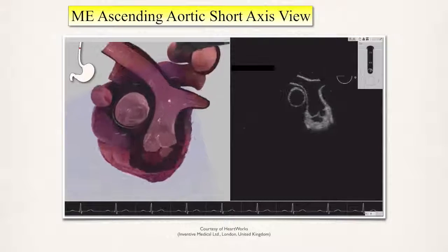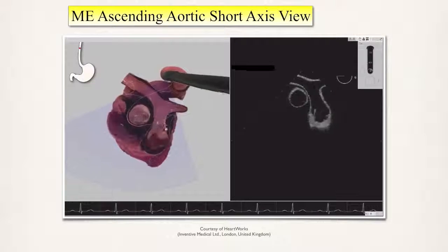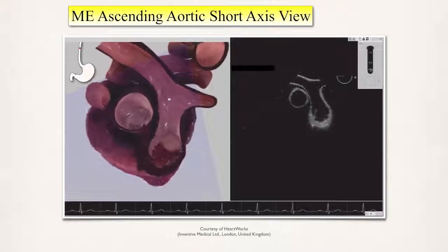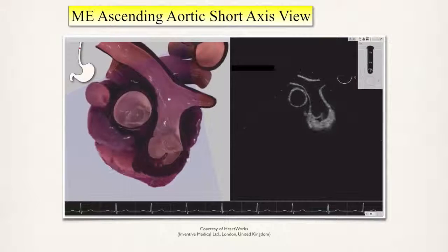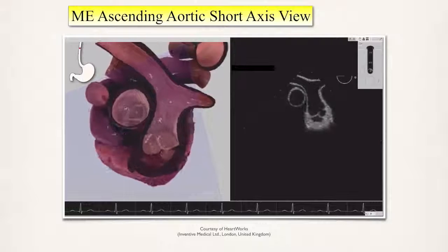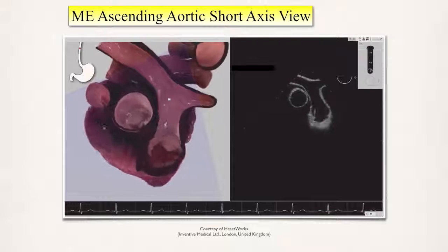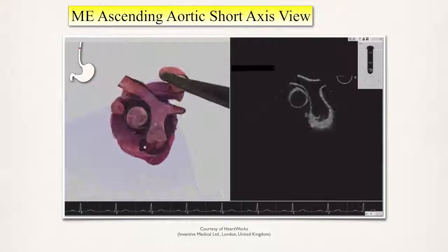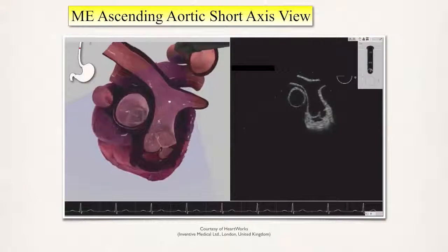This video shows an exceptionally clear view of the structures noted earlier, plus a portion of the left main pulmonary artery after the PA branch, which is rarely seen in adult patients in vivo. The ascending aorta can easily be measured in this view, as can the main pulmonary artery. This view is also useful for optimizing the positioning of a pulmonary artery catheter, which should terminate just inside the right main PA.